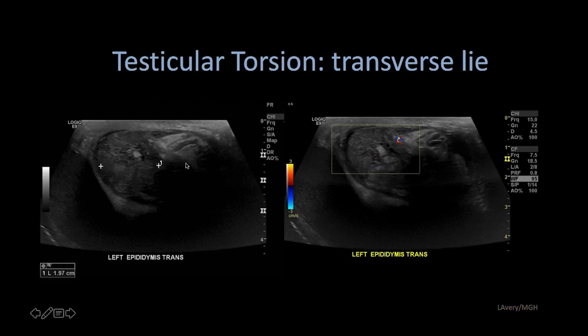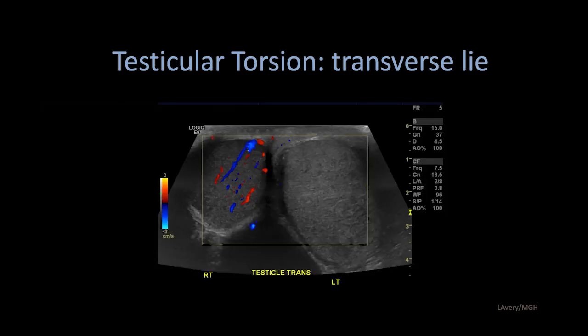The left epididymis is again enlarged and heterogeneous in configuration, but without increased blood flow — an enlarged heterogeneous epididymis without blood flow. On the buddy view, there is lack of blood flow in the left testicle, consistent with testicular torsion.